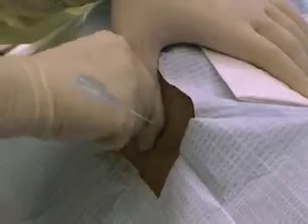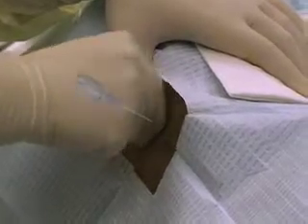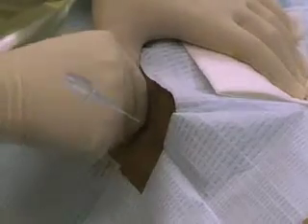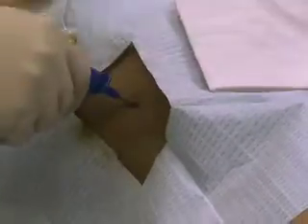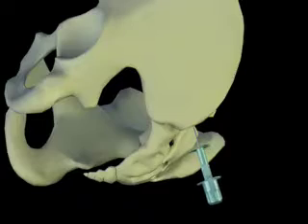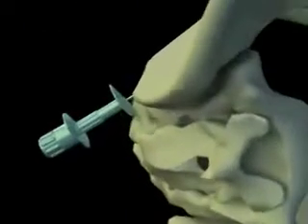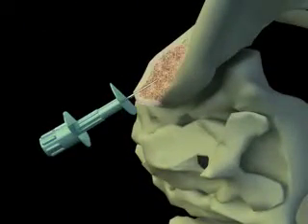To engage the bone, the needle should be rotated alternately clockwise and counterclockwise while applying steady pressure. When the marrow cavity is entered, a sudden decrease in resistance is usually felt. The ilium is a large bone, and the marrow space should be located easily. However, the angle of entry is important. In general, the needle should be advanced at an angle completely perpendicular to the bony prominence of the iliac crest.